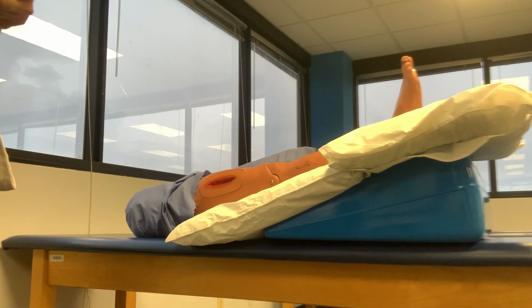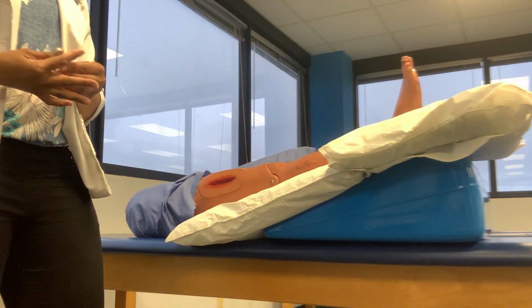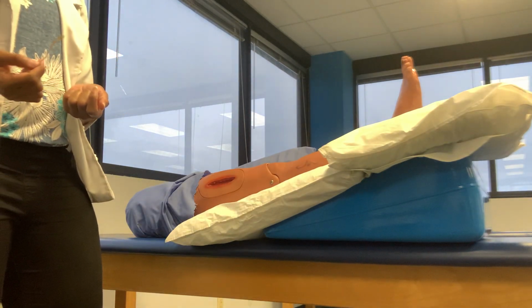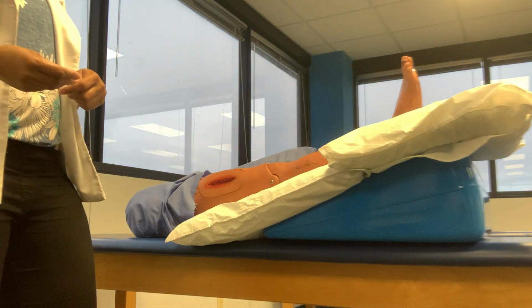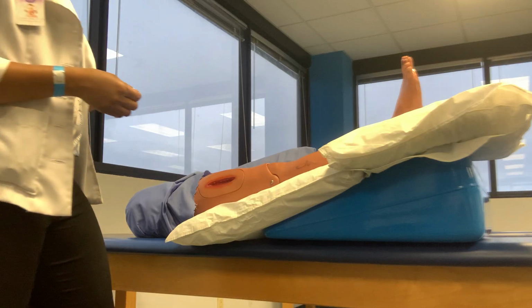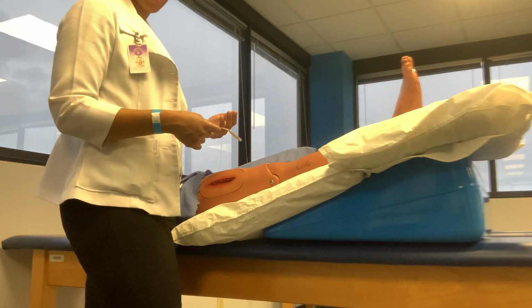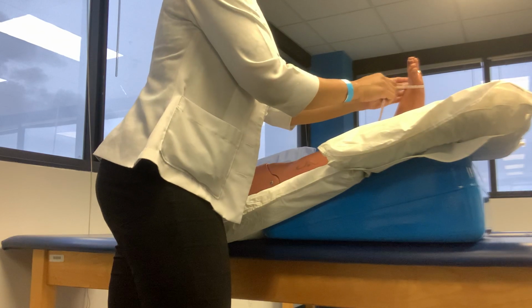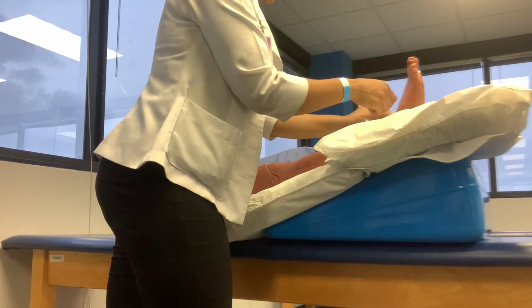Then we need to take their girth measurements, because we need to be able to see if the intermittent compression is having the positive effects that you want. Again, in the interest of time, we won't have you go through the entire method of girth measurements, but what I would say you do is we're going to do a couple key landmarks. So you would do around the metatarsal heads, you take a measurement there, you take a measurement at the ankle.